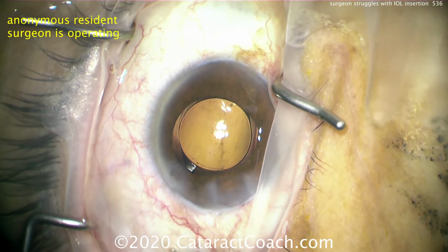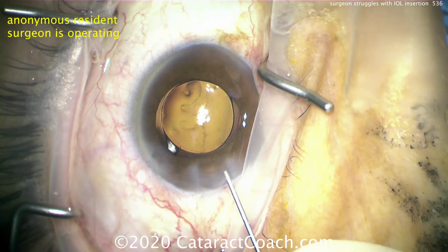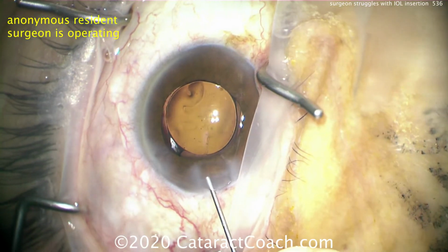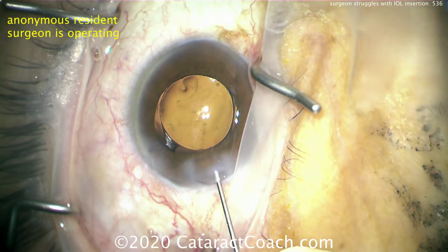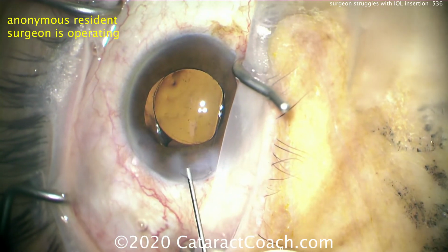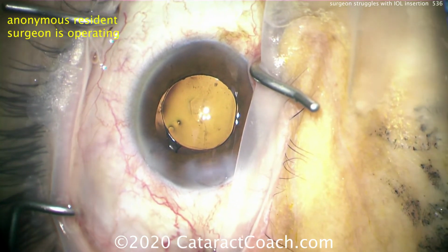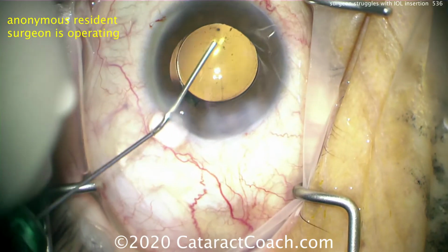It looks okay, right? Well, seal up the incisions, see what happens. So seal up the incisions and get the AC inflated, and look how the IOL gets mispositioned. It gets malpositioned. The IOL is now shifting over. What is going on here? Why won't the IOL stay centered?